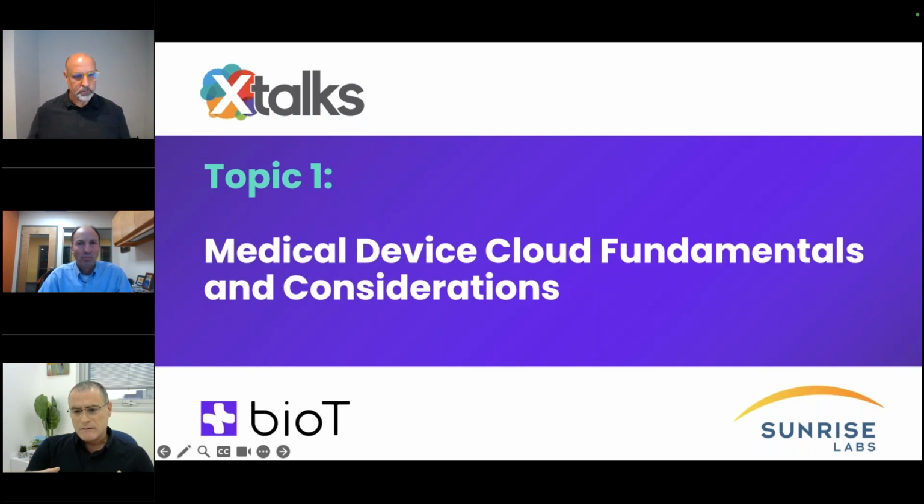On the cloud side, you can talk about responsibilities like activation of the device, authentication, storing and analyzing data, managing the device, collaborating with ecosystem players, even bringing in code and algorithms of third-party tools, sharing data, and of course exchanging data and workflows with EHRs, EDCs, and QMSs.